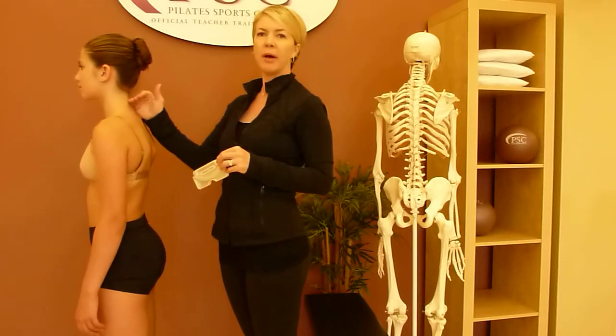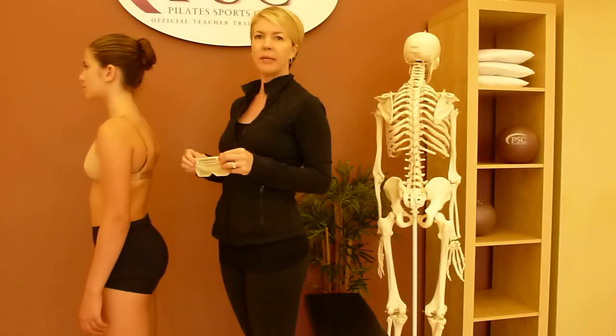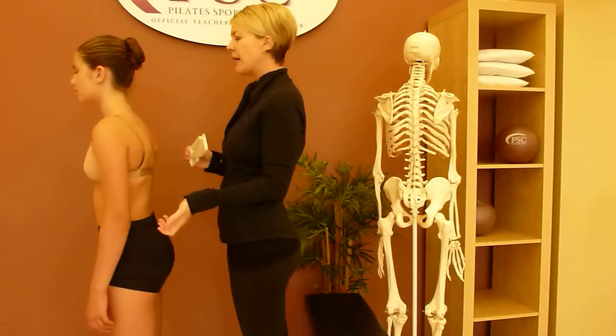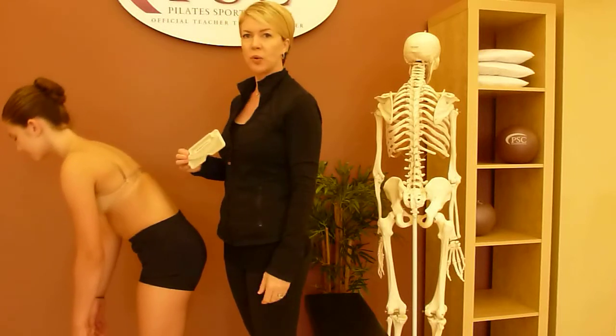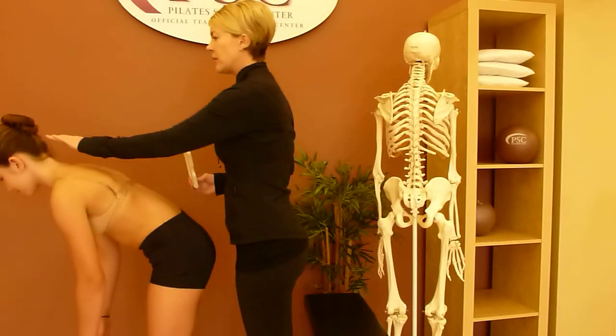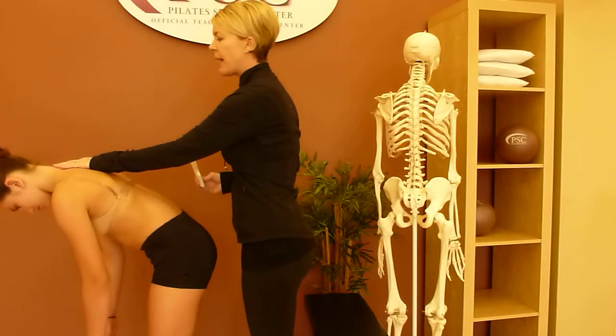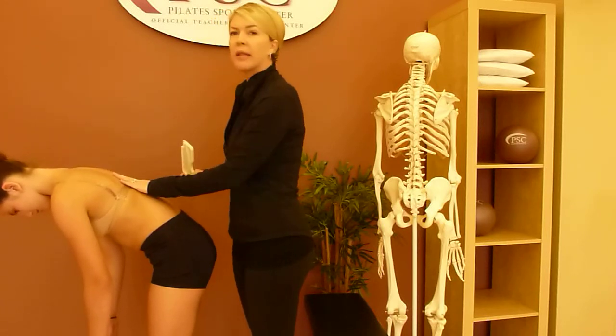We're going to start at the top of the spine and work our way down incrementally. We're going to begin by having her fold over very relaxed, head and arms hanging towards the floor, and let your head go. We're going to have her go as far as where her upper back, her thoracic spine, is parallel to the floor.